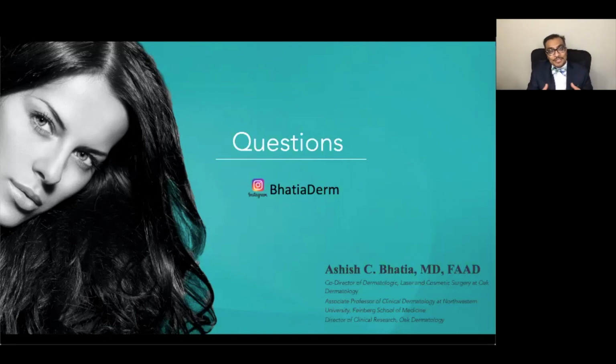Second question, how are you using Green Genesis in your practice? So Green Genesis is fantastic. We use that to take care of a lot of widespread brown lesions where patients don't want a lot of downtime. They don't mind coming in multiple times, but they like a quick procedure that's painless and helps get rid of the brown spots in a slow, gradual manner. It actually helps quite a bit with poikiloderma as well. So those are the 2 areas we use that.